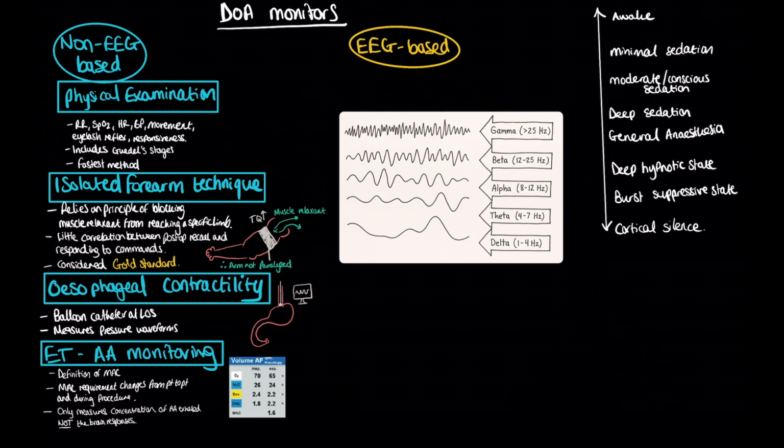This is a pictorial representation of the different types of waves seen on EEG. The different waves at different frequencies get classified into 5 different classes. A tip to remember in decreasing order of frequency is the mnemonic "Great brains achieve through dreams," which corresponds to gamma, beta, alpha, theta and delta. Feel free to make your own mnemonic to help you remember.